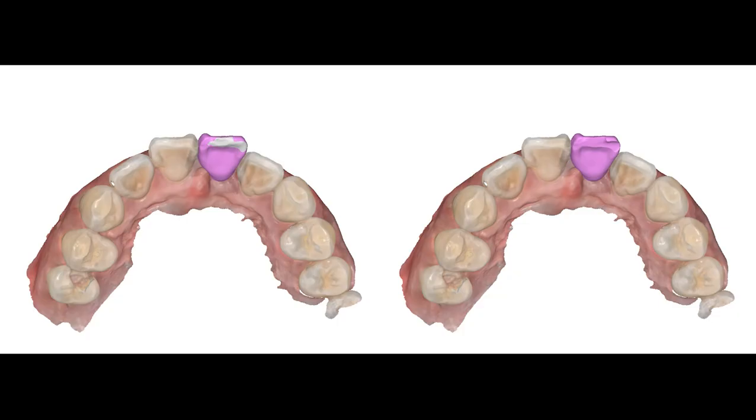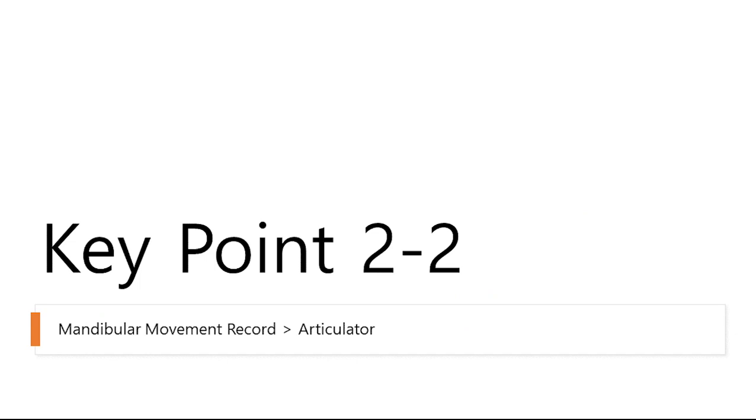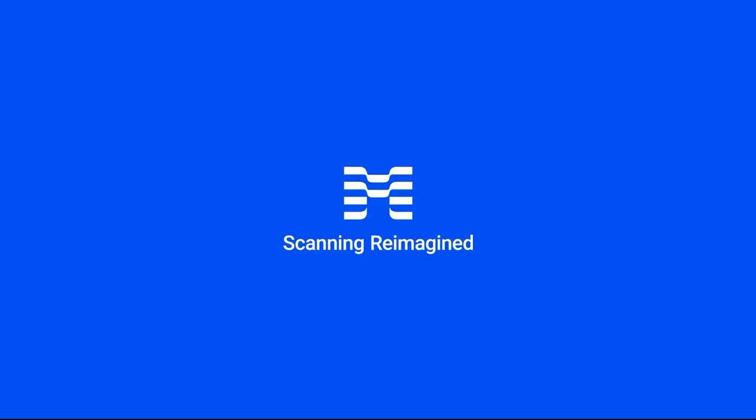With this amount of intraoral occlusal adjustment, the length of the crown that you see may be shortened. You may have to take it out a little bit buccally to get the crown length. As a result, if the crown is made with only articulator adjustments, it may need to be ground down a lot or remade. Conclusion number 2. Using mandibular movement recordings to create a crown is more meaningful than using an articulator.